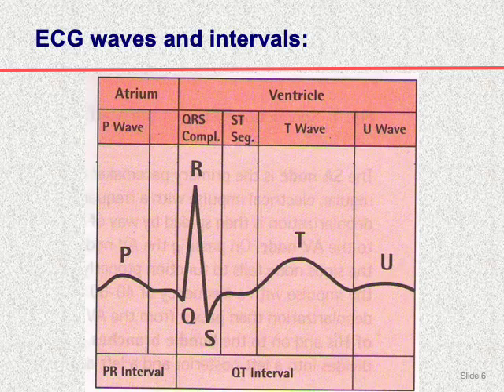Each letter of the QRS can be written as small or capital according to the size. If it is small, it will be small. If it is large, it will be large.